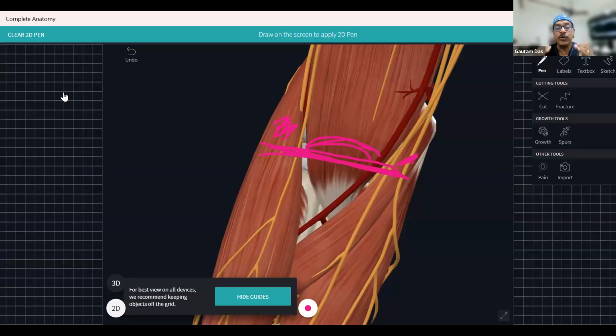So anteriorly, when you are holding the probe at the lower end of the humerus, how will you identify it? By the undulating, curved, very prominent cartilage. Remember how hyaline cartilage looks: it looks like a hypoechoic black horizontal line along with the hyperechoic line. I'll be showing you. When you are there, stop and try to find, in the middle, this pyramidal-shaped muscle, your brachialis. On one side is the brachioradialis, and this is the brachioradialis.